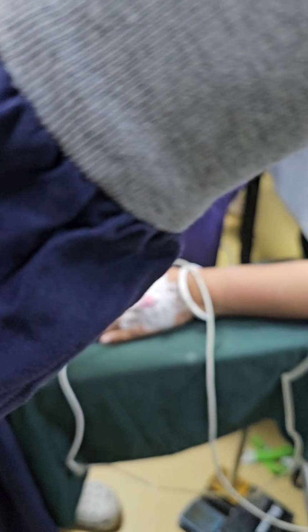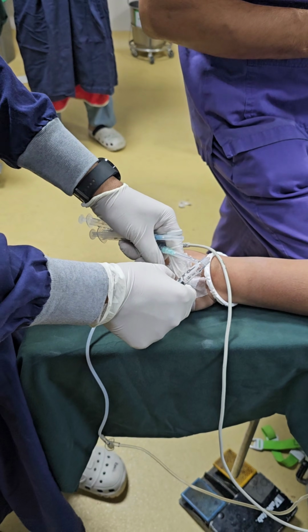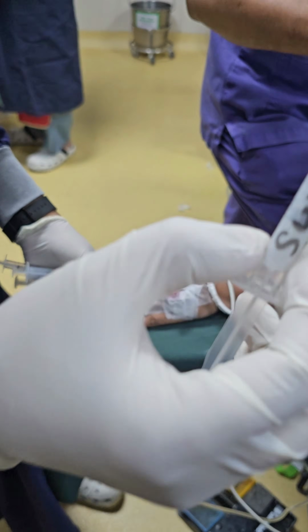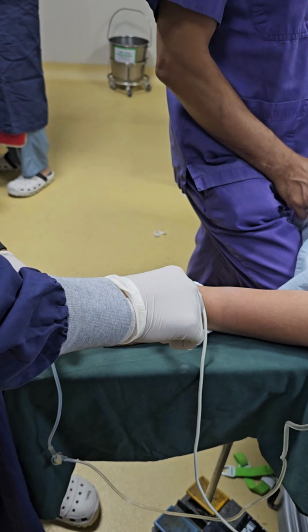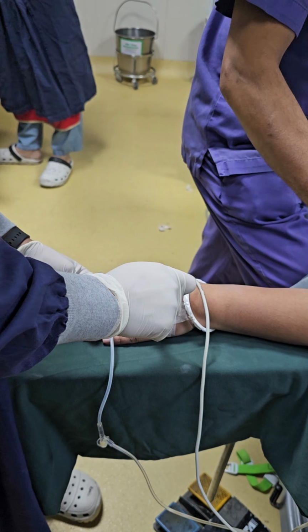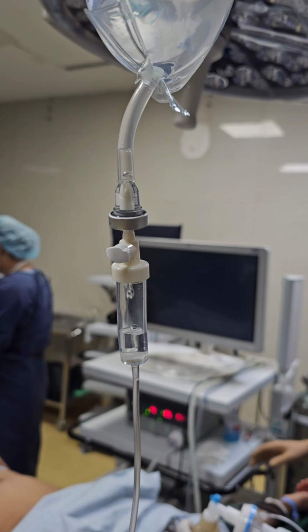Now we are giving the depolarizing neuromuscular blocking agent, which is suxamethonium. And suxamethonium has been given. After giving the suxamethonium, we can see fasciculation in her hand. We are waiting for the fasciculation.